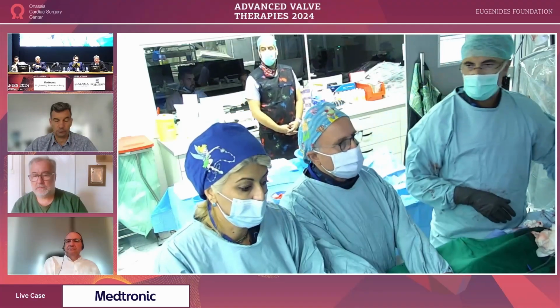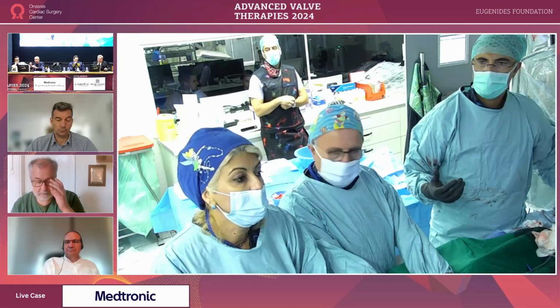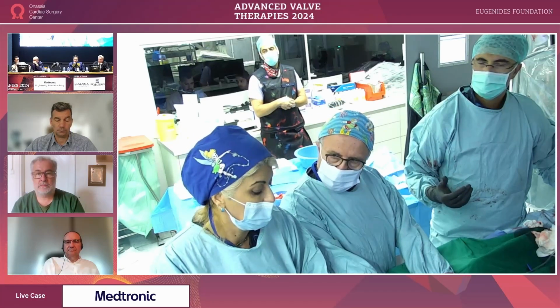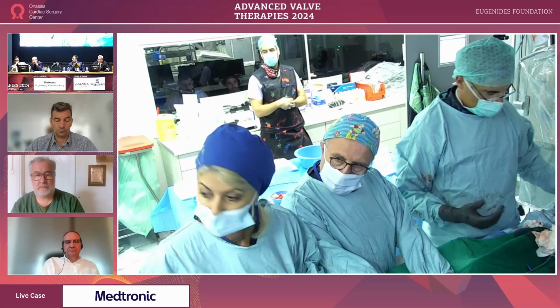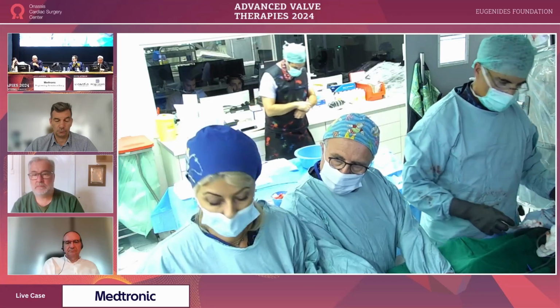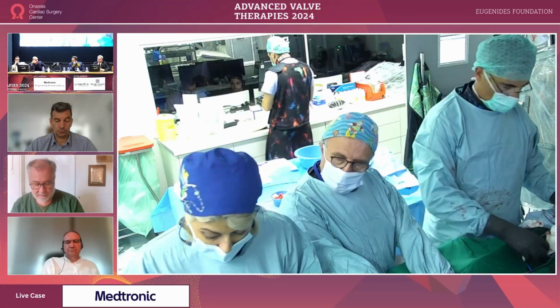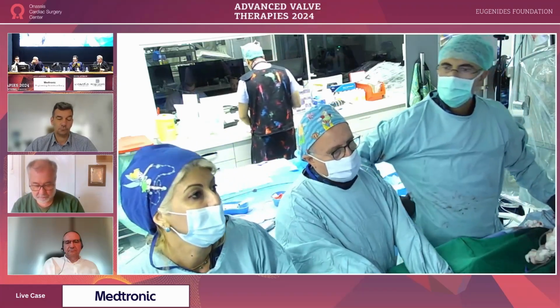So I think we will leave it there. In case you need something else, Arik? No, I think it's as I said from the beginning. It looked like a challenging case, with a very, very unstable valve. It was just dancing from the beginning.